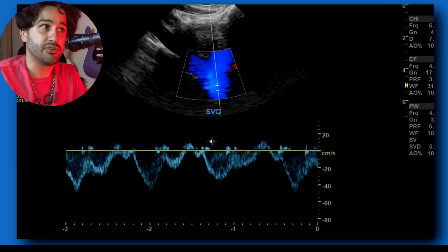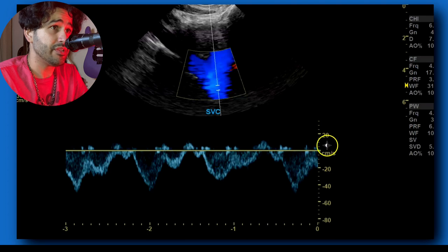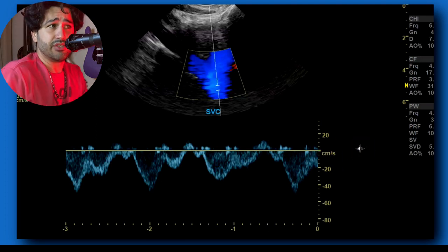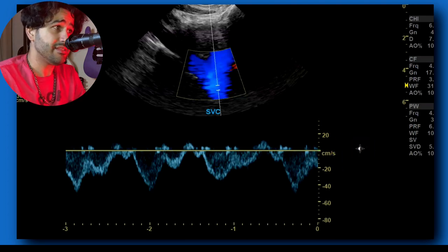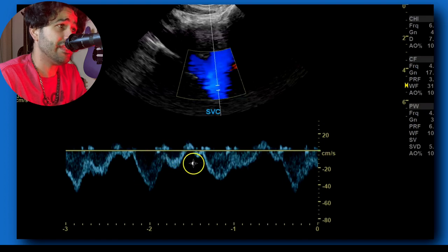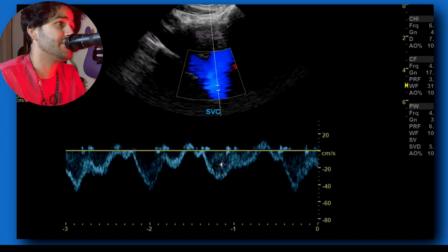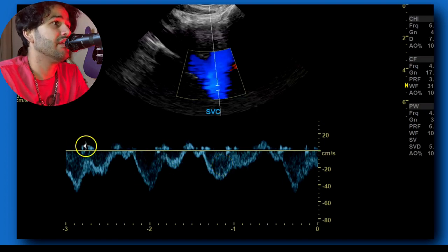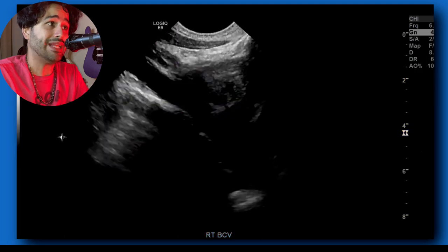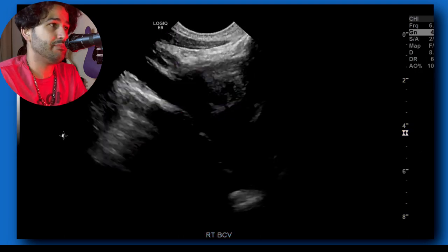After that, spectral doppler. Always make sure you have your gain, your scale, and everything set up nicely. You'll see it's a little phasic — that's from respiratory variations. Then on to the right brachiocephalic vein.